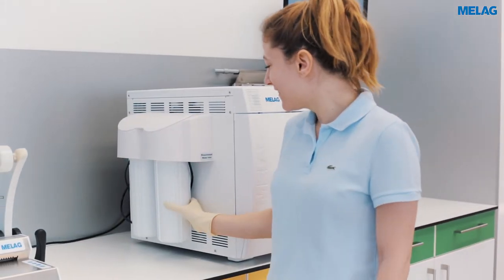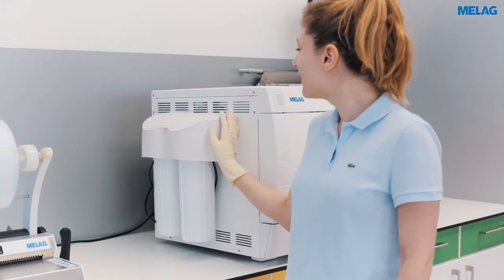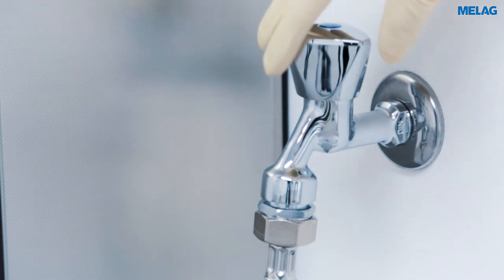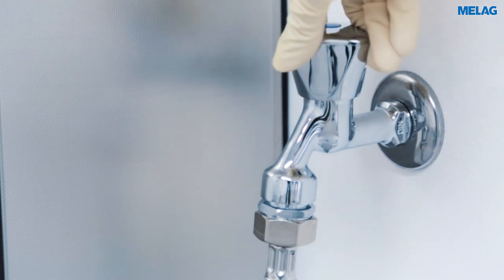Please change the mixed bed resin cartridges as soon as the warning is displayed. Before changing the cartridges, please close the tap of the water line.